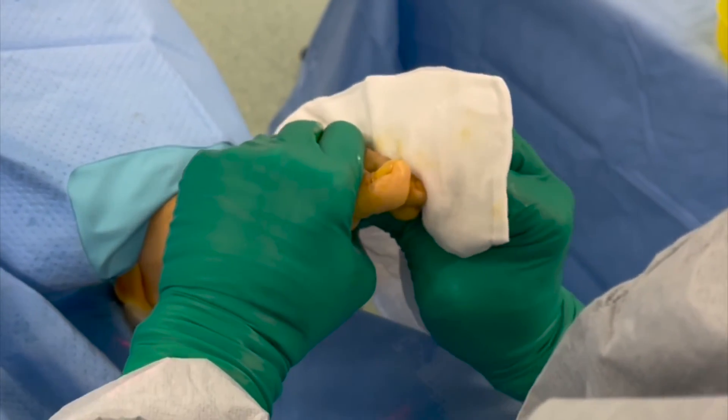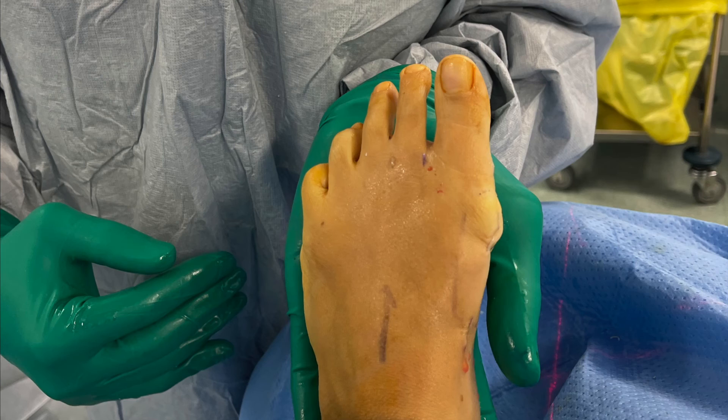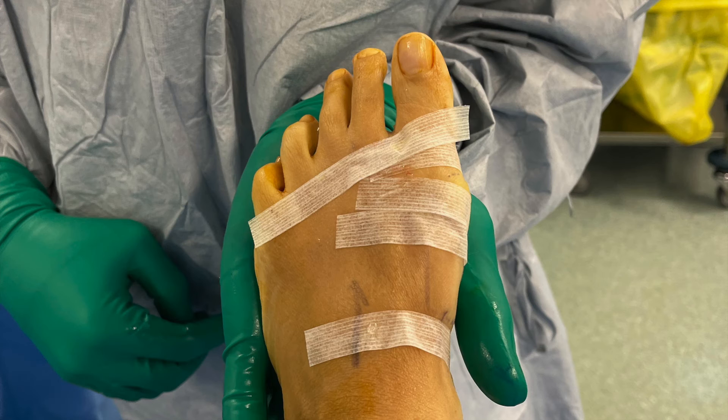The toe can be manipulated in a similar fashion to the second toe in order to achieve the final deformity correction. The final results can be seen here. The wound is closed with a Steri-Strip only, with no need for any subcuticular or external sutures.